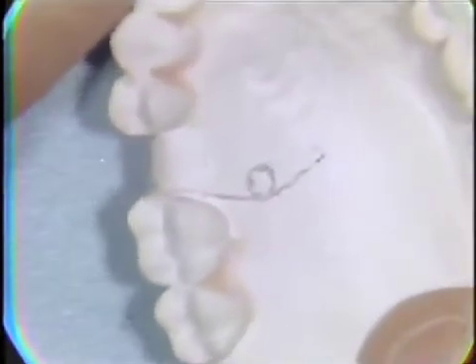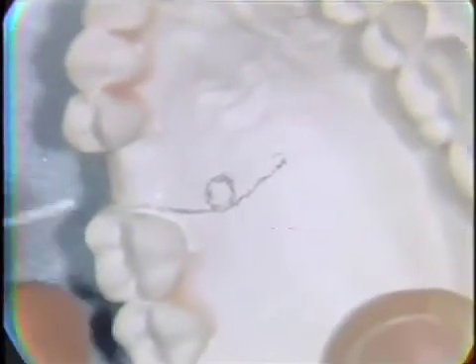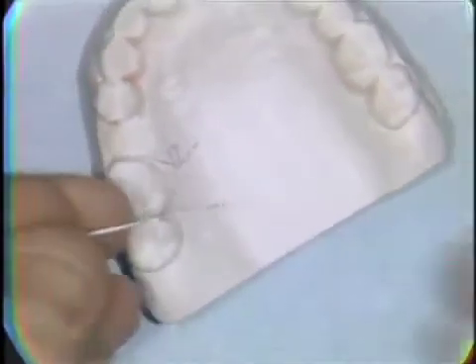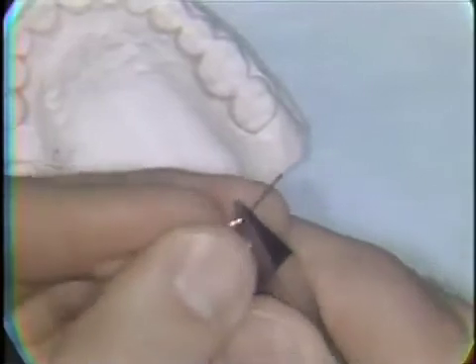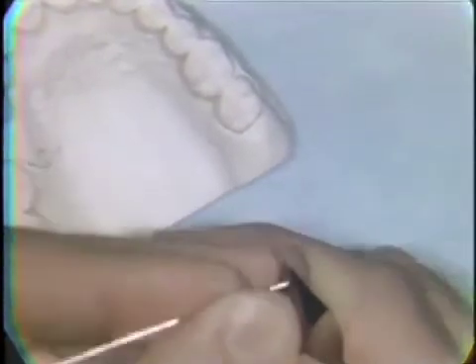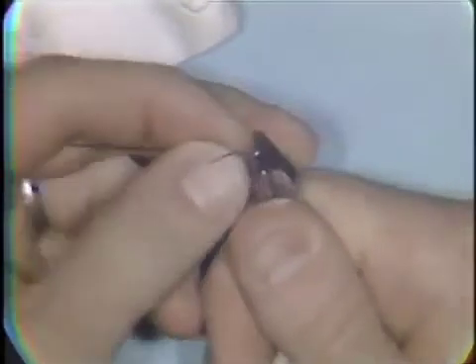Proper spring design is a large factor in producing the desired tooth movement with a removable appliance. The first step in spring bending is to make a helix near the end of the wire that you're going to form into the spring. The wire is bent around the round beak of the pliers and tried back on the pencil outline.